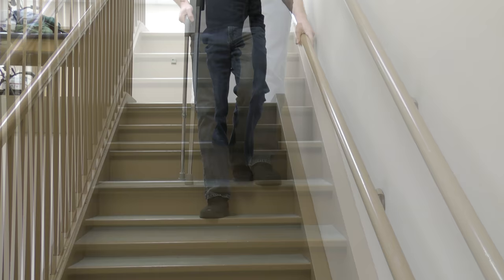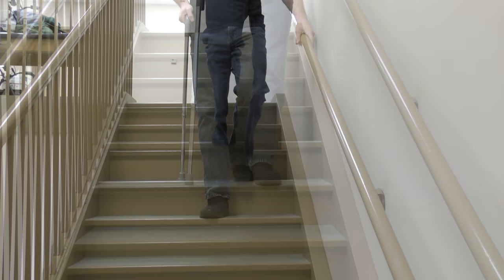If done reciprocally, simply keep the cane on the same step as the involved side. Remember to always hold the rail.